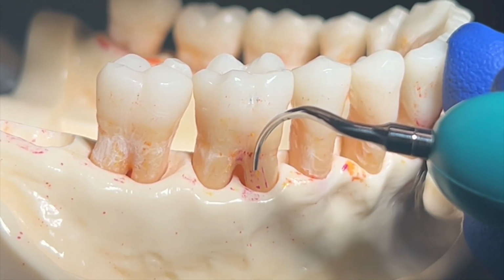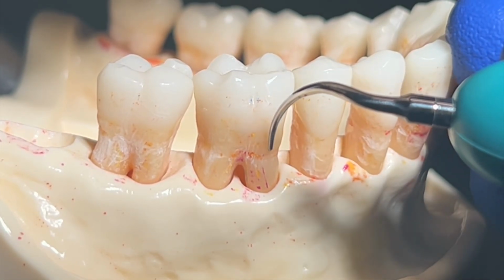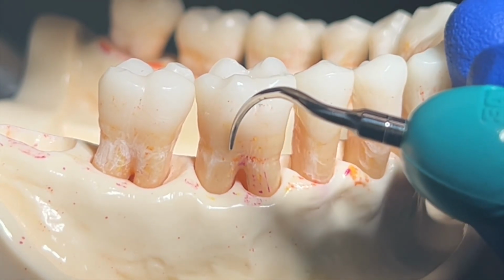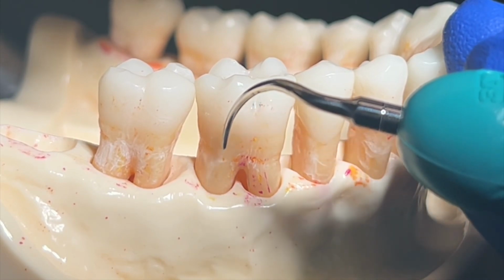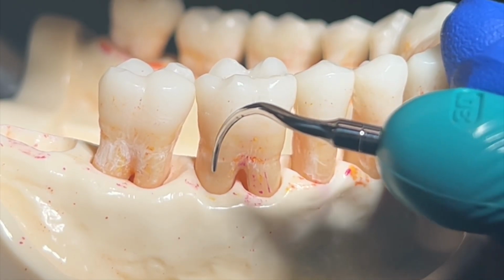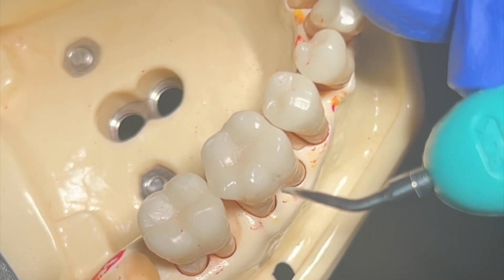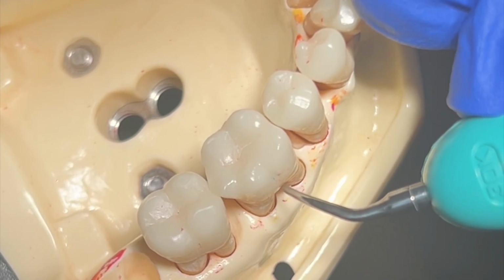Remember that all sides of the magnetostrictive are active. However, when using the right and left inserts for the vertical technique, the clinician must ensure that the back of the insert is adapted to the tooth structure, specifically in furcations. This is because the back of the insert is the least active part. The tip of the insert is pointing towards the apex of the tooth like a probe.